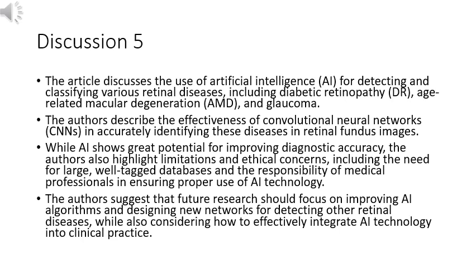One of the limitations of this study is the inclusion of multiple images, from multiple devices and photographers, some of which only include 40, 45, and 50 degrees of the central retina. However, this same limitation could also be a strength for the resulting algorithms, which could be more reliable for use in the real world without having to worry about camera brands or types. The only significant barrier would be the accessible AI filter.